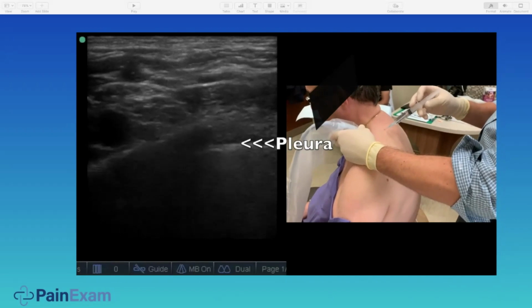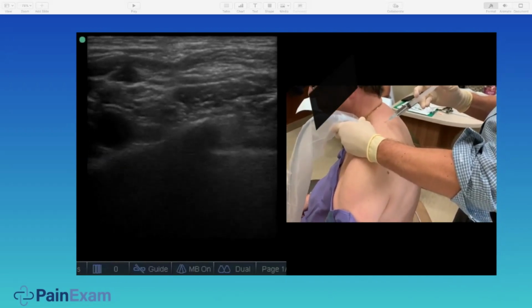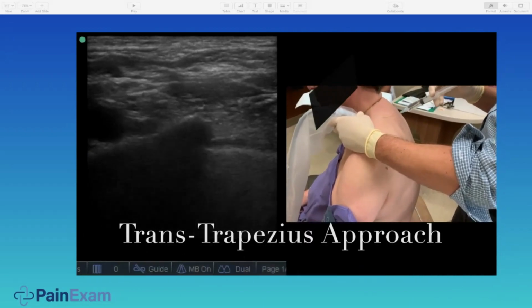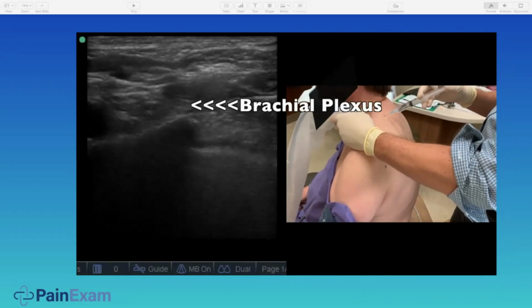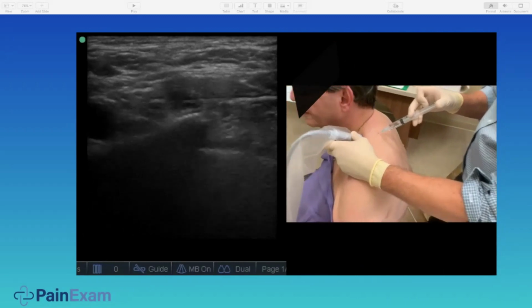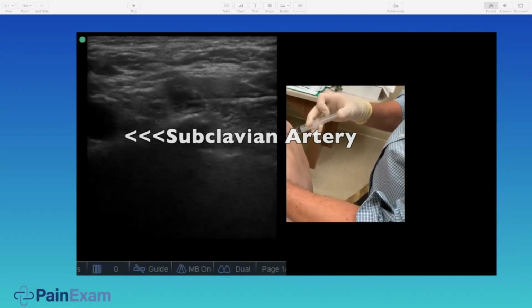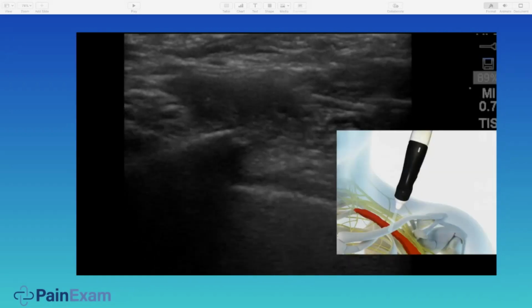Never seen a vasovagal from this. I'm also not giving 30 mLs of local here. I'm giving this block of bupivacaine for a patient who's undergoing a shoulder stem cell procedure. As you can see, I'm using a 25 gauge, 3.5-inch needle, and I can see it quite clearly. The artery is forward, the lung is underneath. As long as I can see my needle like that, there should be no reason to get an intravascular injection or pneumothorax.